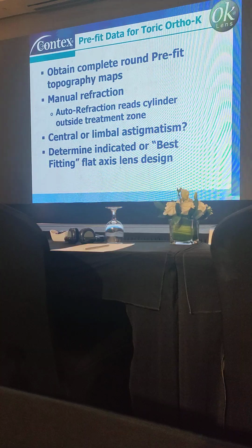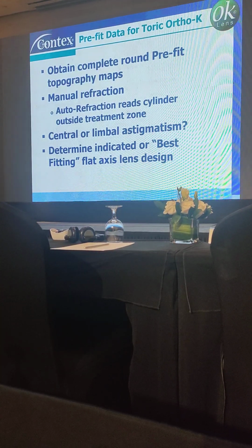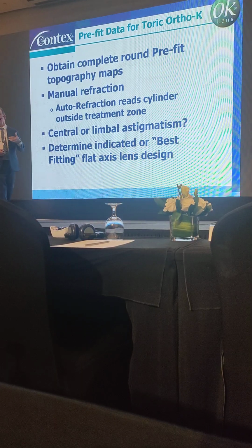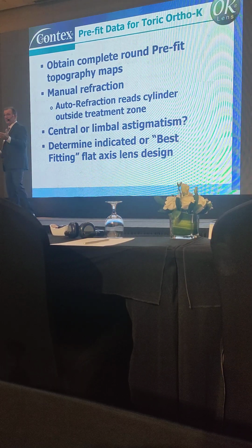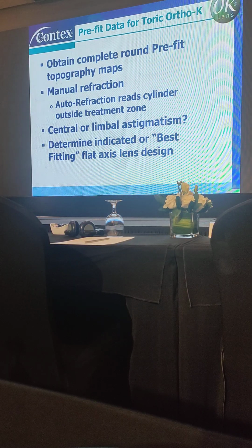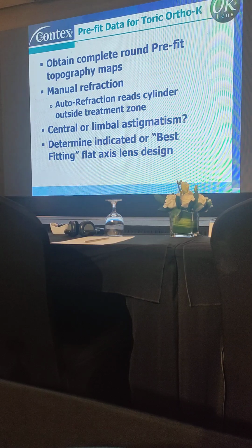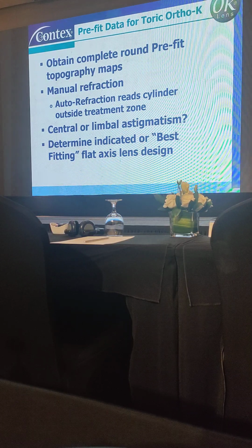The manual refraction. When you use an autorefractor after Ortho K, it picks up the steep reverse zone and depicts it as astigmatism.